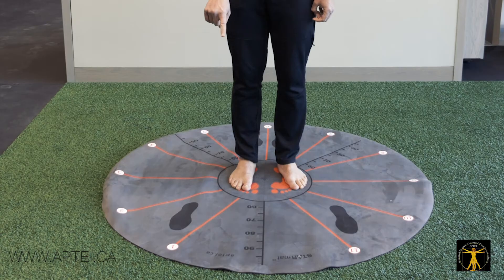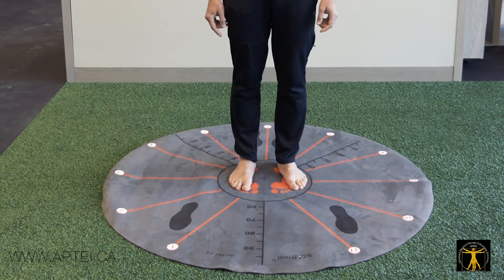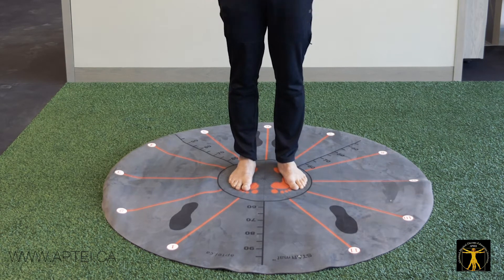The StarMat has 12 clock numbers on it — 1, 2, 3, 4, 5, 6, 7, 8, 9, 10, 11, 12 — and you can do a series of unlimited exercises on it.